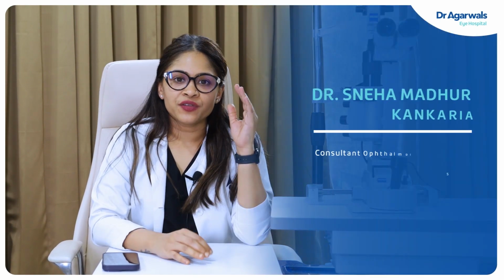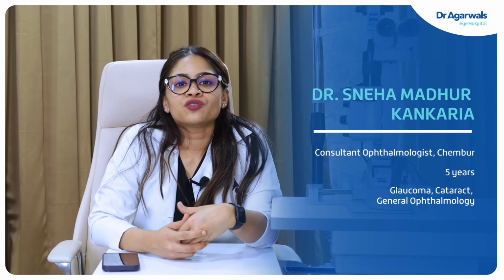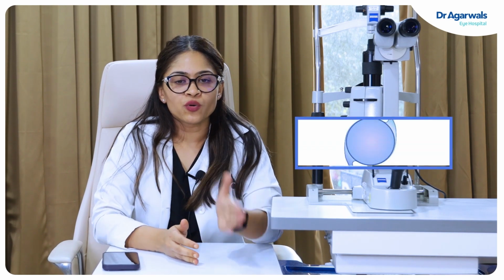So what sort of lens should we go in for is what most of our patients always ask. And should we go in for a monofocal, a trifocal, or an EDOF? So what exactly are these? For a person to see clearly after cataract surgery, it requires an implantation of a lens, which is going to be an artificial intraocular lens.